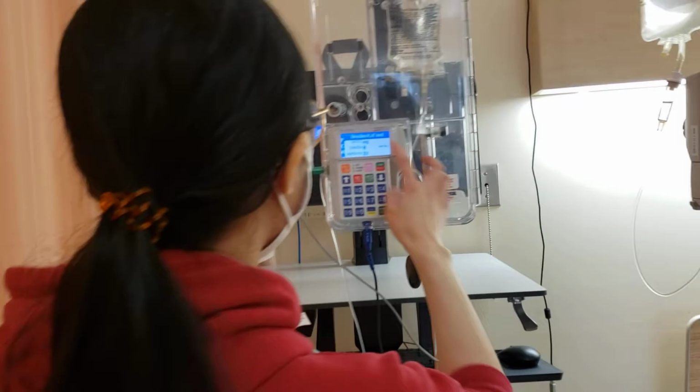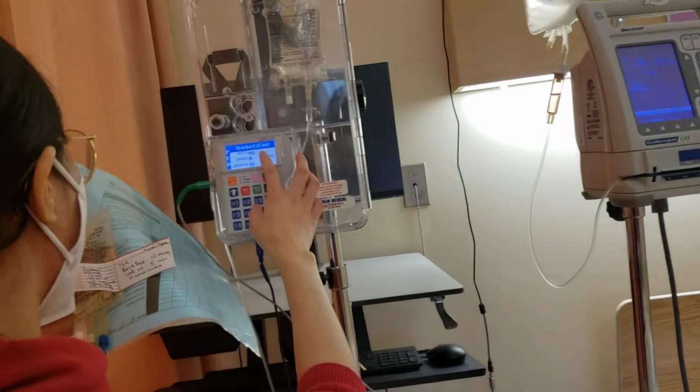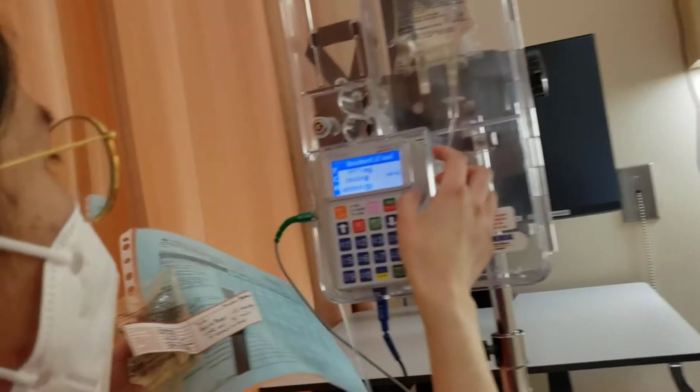Okay, so we make sure that we have the right unit. So we need micrograms.